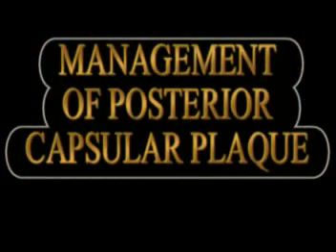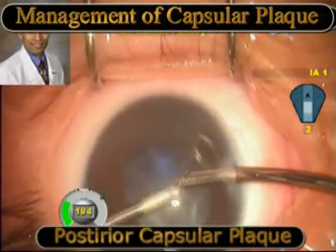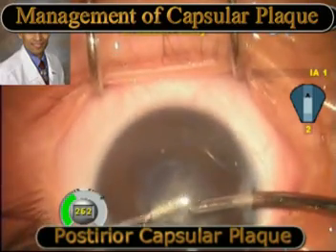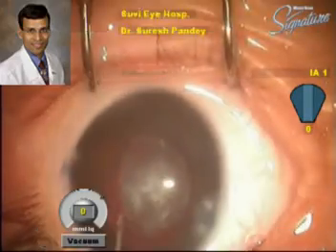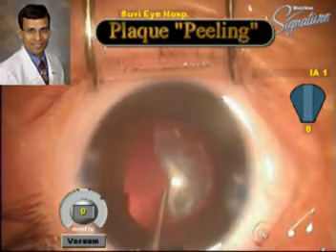Some of these cases can also have a similar dense plaque in the posterior capsule. Sometimes there may also be a pre-existent dehiscence of the posterior capsule which may need to be managed appropriately. As seen in this case, the cataract is fairly soft, removed with irrigation aspiration, and now this is the posterior capsule plaque that we have to deal with.